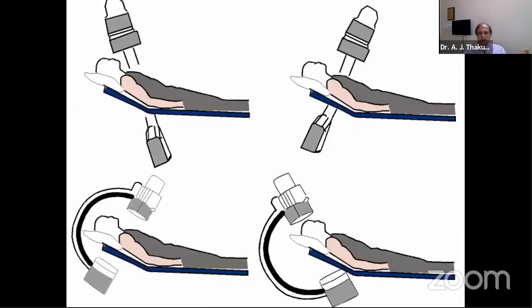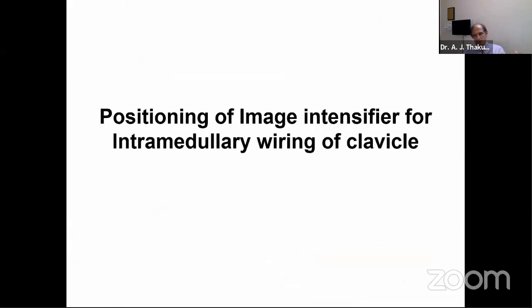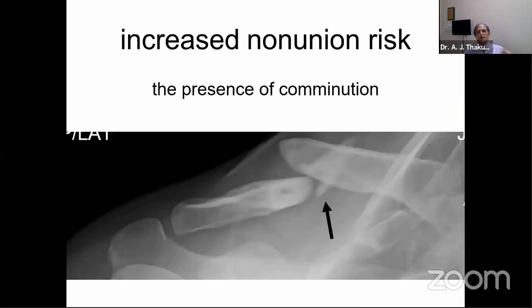Image intensifier, of course, we all know how to use image intensifier. These are the two most common positions. The surgeon stands on this side. The image intensifier is opposite the surgeon, or it could also be at the head end, and by rotating it this way and that way, or by these two positions, one can visualize the shoulder in 90 degrees of each other, which is the easy way. Sometimes we resort to clavicular wiring, but there it requires a special type of positioning.